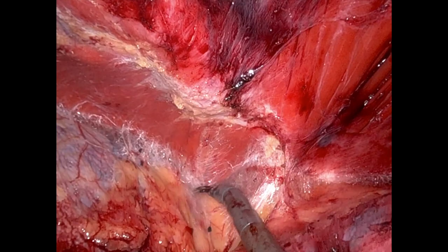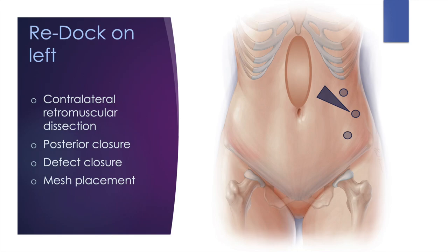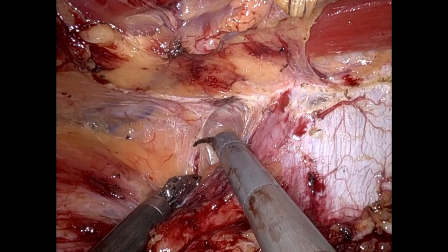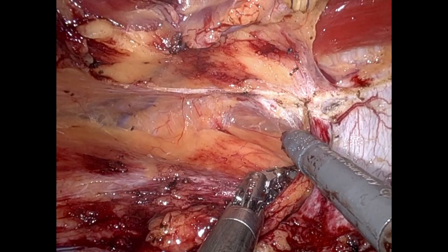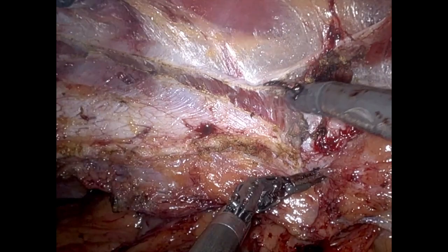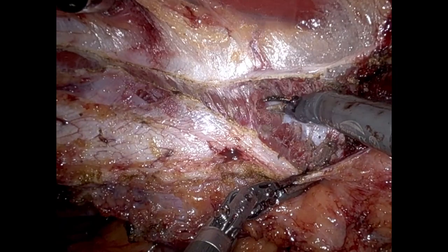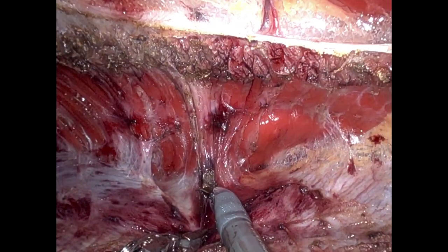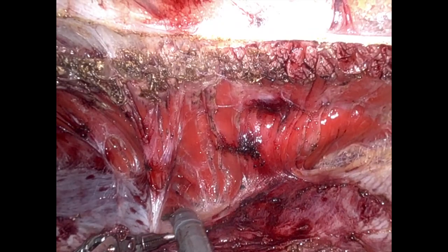At this point we have a very solid dissection extending to the lateral aspects of the abdominal wall. Not depicted in the video, we closed all of those small holes in the posterior sheath, then redocked and started on our contralateral retromuscular dissection. Here, demonstrating the dissection that happens around the level of the arcuate line during our bottoms-up TAR, and then showing a more traditional top-down TAR releasing the transversus abdominis, extending our dissection laterally and exposing the retroperitoneal fat.